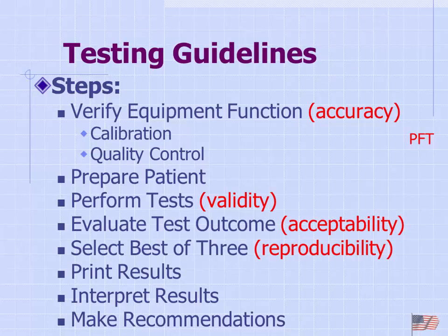We're going to go through some process of making sure that our equipment is functioning, and every day that we do pulmonary functions, we're going to do a quality control on it just to make sure that it's operating correctly. We've got to make sure the patient's prepared. We want to make sure that they have not taken their medication, that they have not smoked.